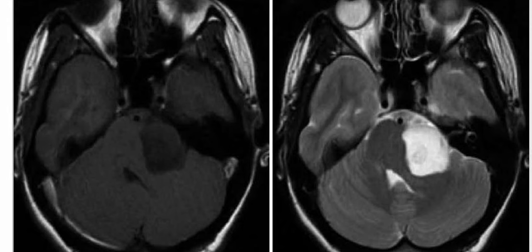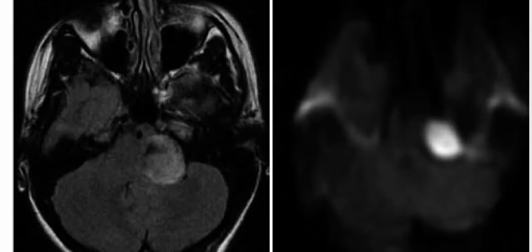So next we have a 23-year-old woman who presented with headaches, and this is the axial T1 weighted MRI and axial T2 weighted MRI. It shows a left cerebellopontine angle mass which is iso to slightly hyperintense to the CSF signal. Also on the FLAIR and DWI sequences, we can see that this lesion is showing increased signal intensity. On the FLAIR sequence it is hyperintense, and on DWI as well, it is hyperintense.